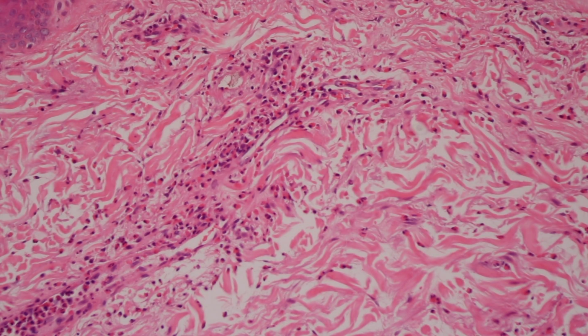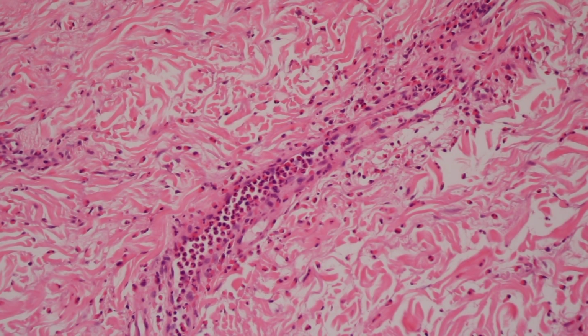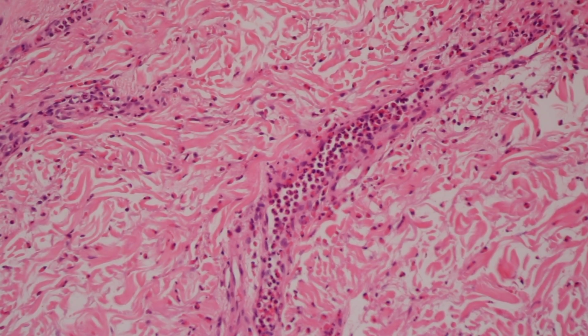The dermatologists are. They have a lot of experience with this. There are some times where vasculitis is suspected clinically and microscopically we don't see it. We see other things causing hemorrhage or thrombus, and that's a different story. But the converse is not true. When there's no evidence clinically, when the skin doesn't look like vasculitis, it's very unusual that I'll see true vasculitis microscopically. So here, the damage to the vessel is really very subtle.